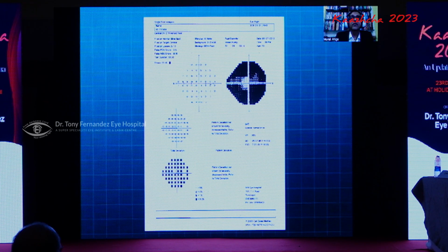And here you can see an advanced glaucoma showing extensive false negatives. A false negative alone by itself does not mean the patient is unreliable. In severely diseased glaucomatous eyes, you will find false negatives are high. This is part of the disease process. So false negatives alone like this need not be ignored and can be interpreted along with the clinical picture.